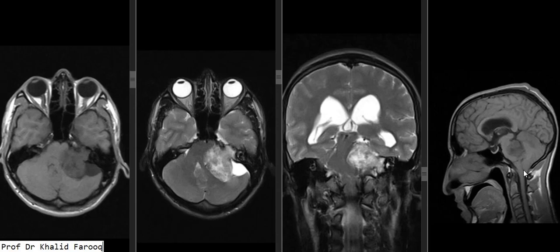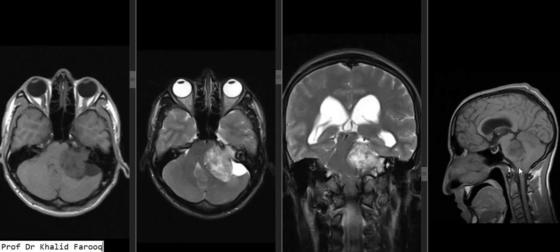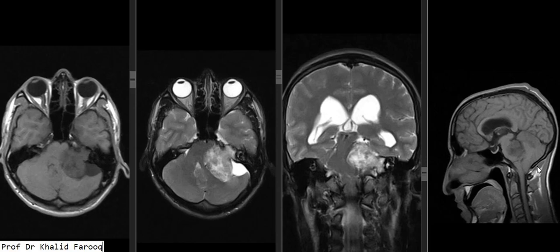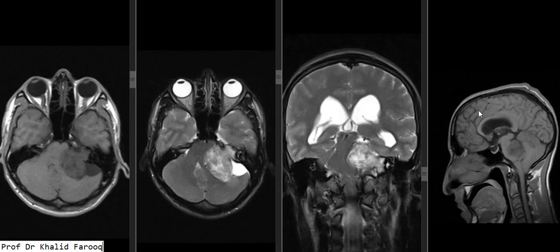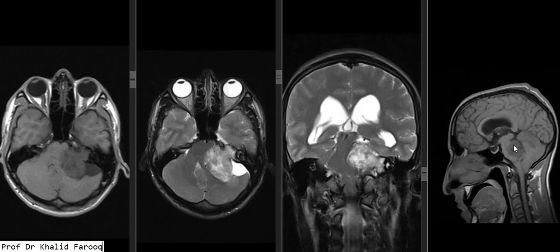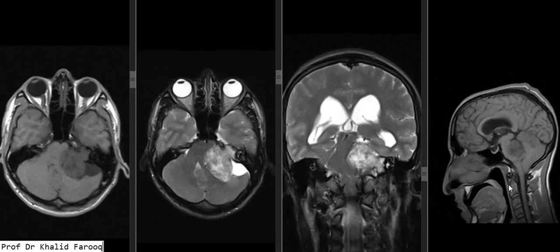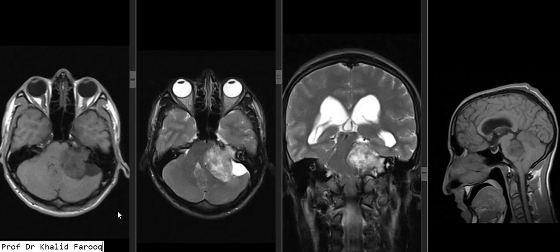We can see there is downward herniation of the cerebellar tonsil and cervicomedullary junction through the foramen magnum. Partial empty sella is also seen. The remaining brain parenchyma is unremarkable. We can see the fourth ventricle, which is compressed. This is a plain study — usually we give contrast for proper assessment and characterization of CP angle lesions.